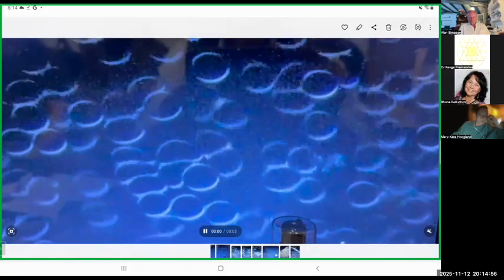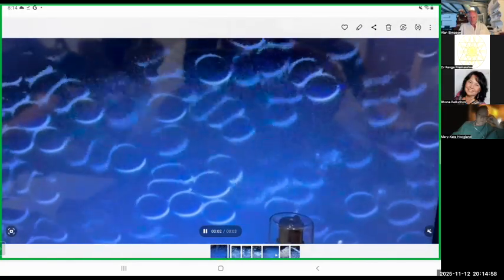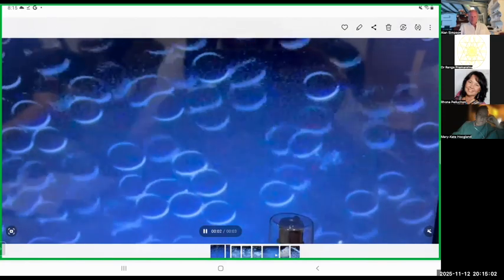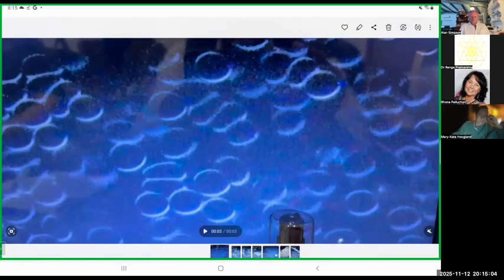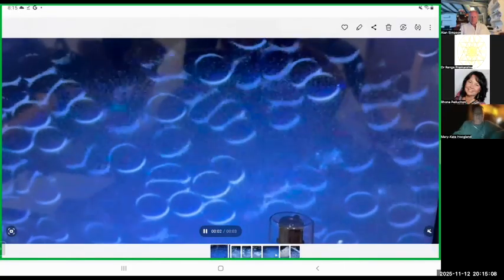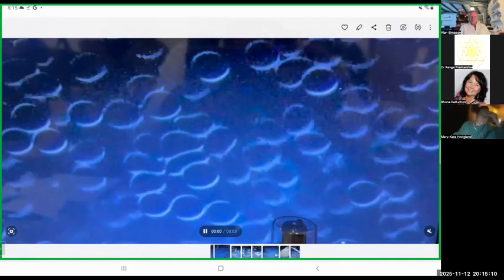This is a really beautiful blood. See, that's how it should be. I'll do it again. You can see how flexible the cell membrane is. This is like after taking that. You can see they squeeze through and move.